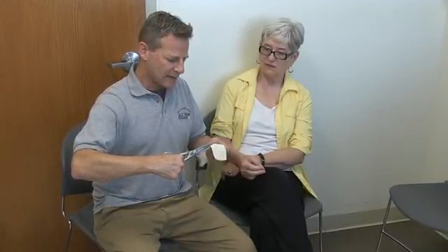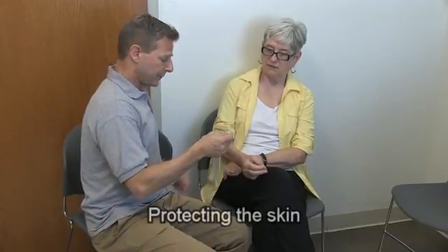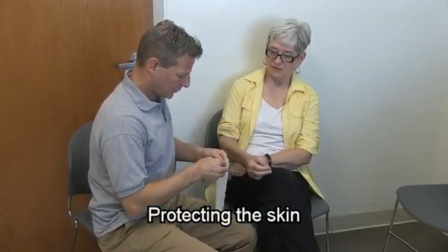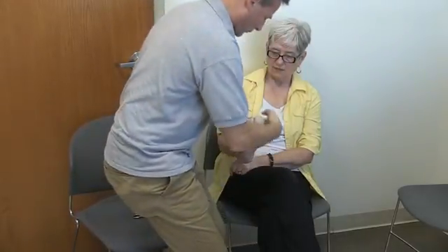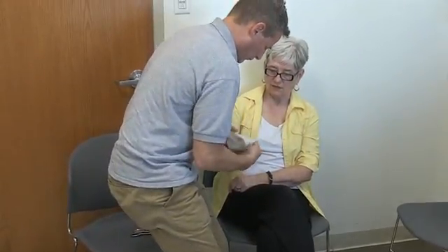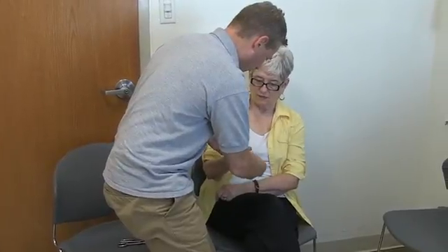Now we're going to place a piece of stockinette on Linda to protect her skin because the splint material is warm. There's a hole here for your thumb.